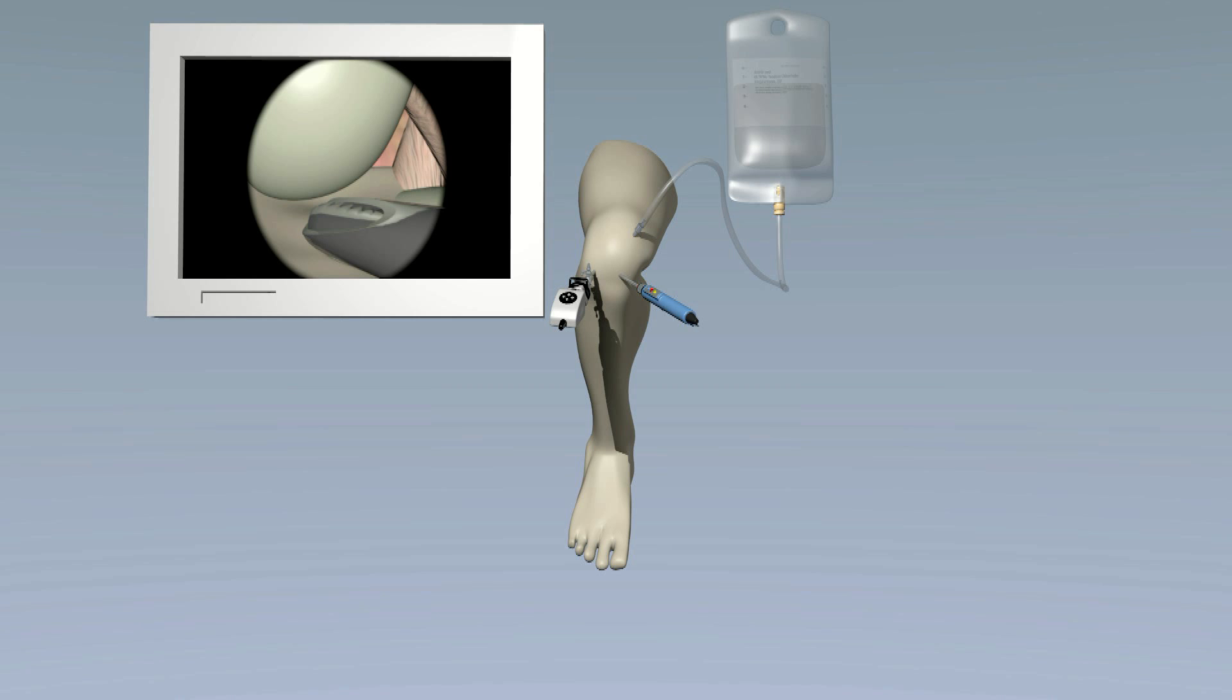A small metal probe is often used to examine different structures within the knee. A grasper can be used to grasp debris that is floating in the knee such as small pieces of loose cartilage.